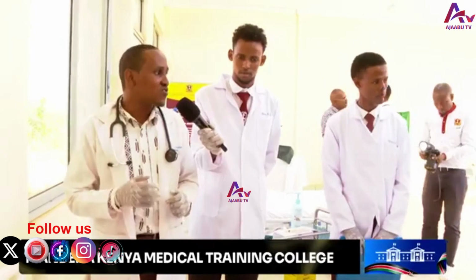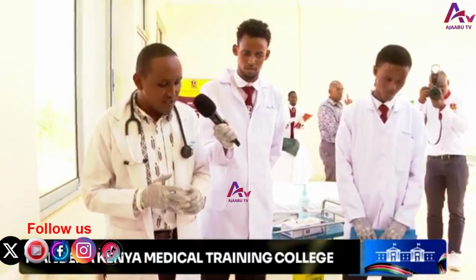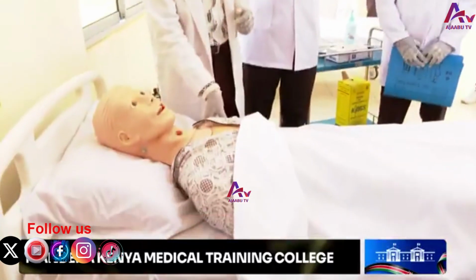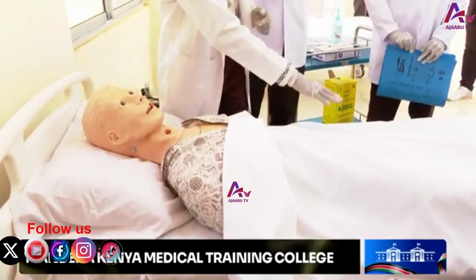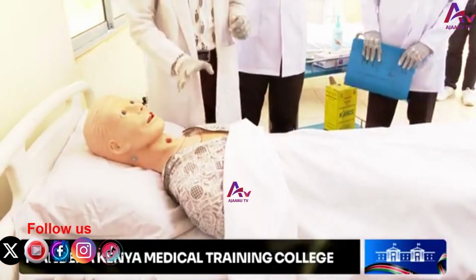IV, through the intravenous. We have got an oral drug administration. For the purpose of this demonstration, we're going to do IM, intramuscular drug administration. The site of drug administration for IM, we have got 3 parts: one at the deltoid region, at the thigh, and then at the back, the gluteal one. We're going to do the deltoid one.